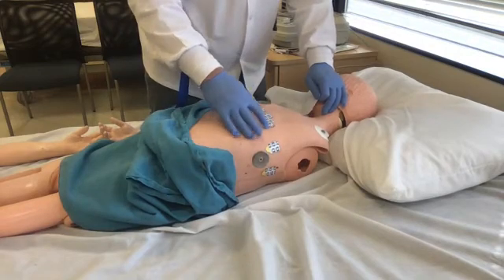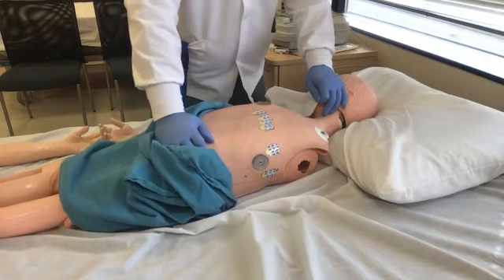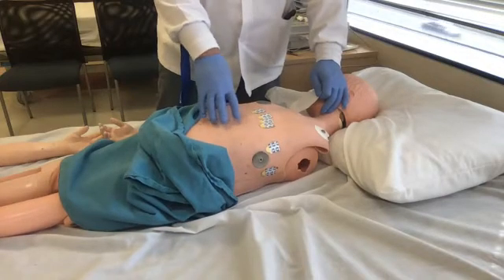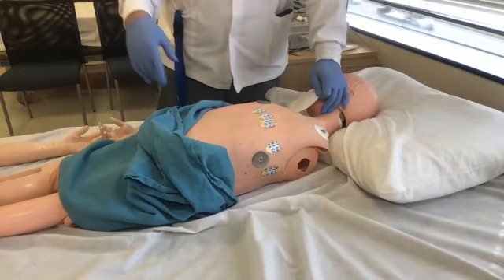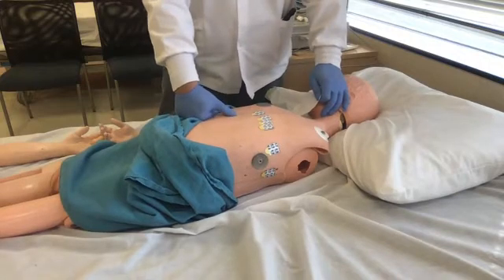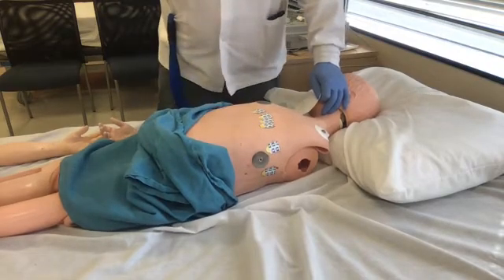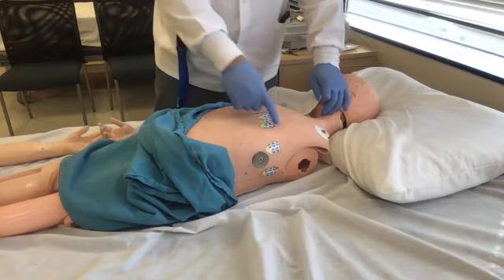There are some schools of thought where they take the lower leads and put them more abdominal. Remember, I teach you the textbook way. It goes based on different machines and different systems. That actually got one of my other students in trouble because she said, Dr. Garais is an internist, and he told me that's not the way you do it. No, this is the most textbook correct way. But in your facility, with different machines and different things, they may want a different viewpoint.